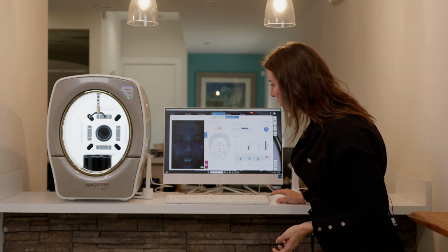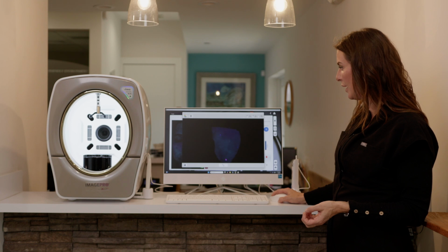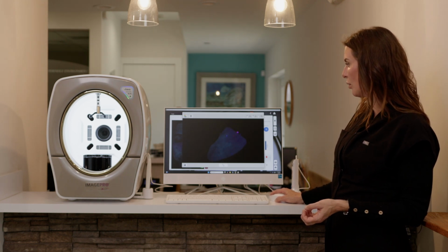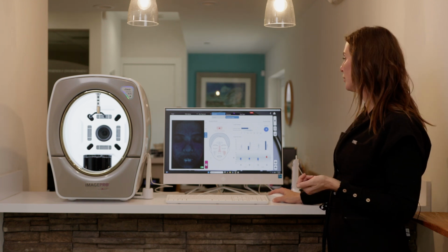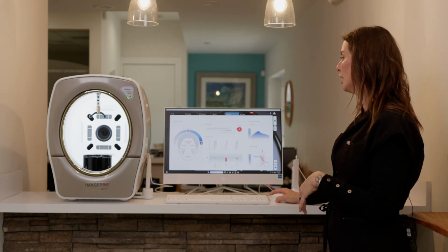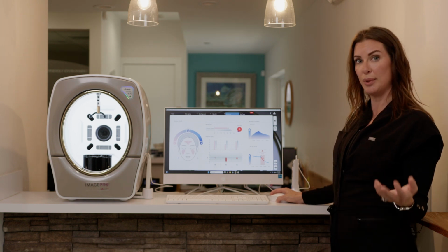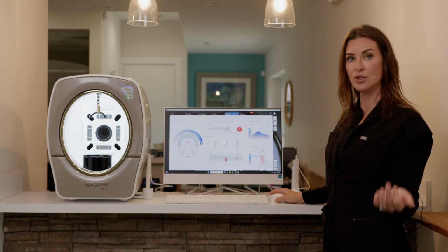Porphyrin, that would be bacteria, and those are highlighted in pink, so she's got very few of those, but again, on an individualized pore by pore basis, you can see where that bacteria lies. She's 5 better off than those of her average age group. And then moisture. So we did take a moisture read on her. She was a little dry, so this would be an opportunity to, again, sell one of those products or any of the services that are going to help hydrate her skin.